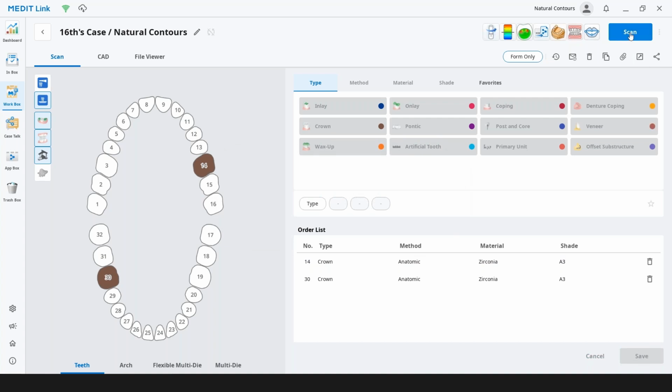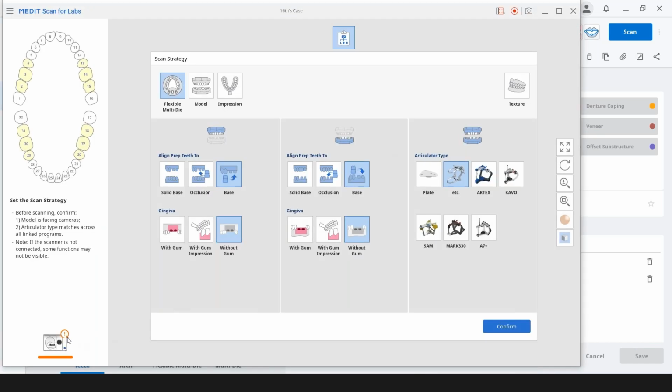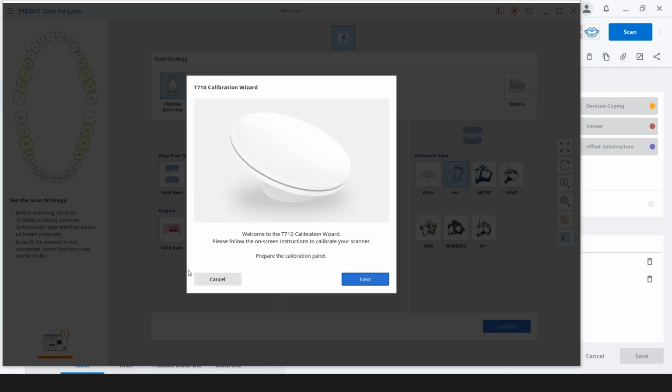And I can go up to the top right, hit scan. And now you can see in the bottom left here, my scanner icon is not green, which means go, but it is orange. So if I click on that, what you're going to do is, obviously your package comes with a scanner calibration plate, which has a QR code on the back, as well as a serial number. So you're going to take that white cover off, and I'll place that on my scanner.